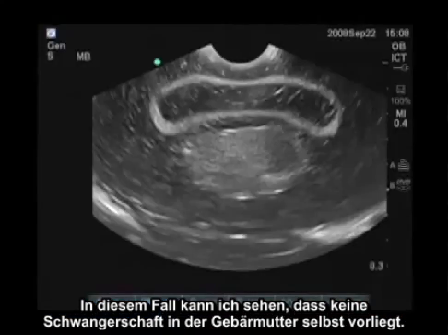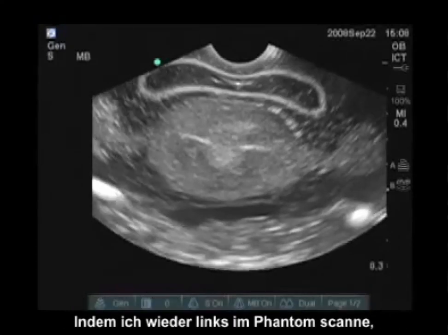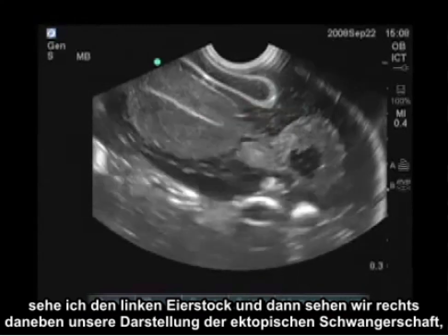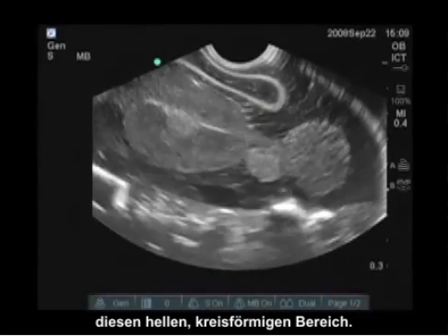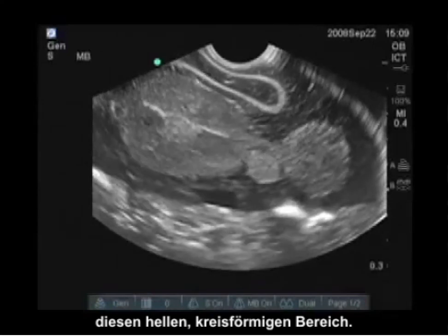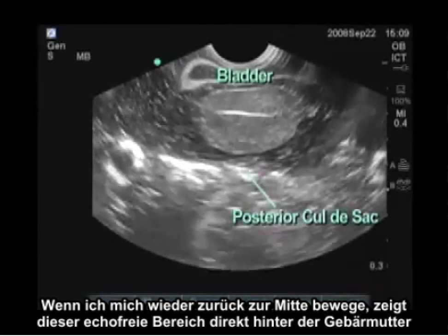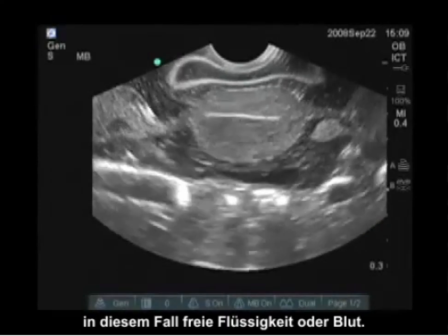Scanning over to the left of the phantom, again we see the left ovary and right beside it our representation of the ectopic pregnancy — this bright circular area. Moving back towards the midline, the anechoic area just posterior to the uterus represents free fluid or blood. Those are the views you would need to do a thorough assessment of the pelvis for early pregnancy.